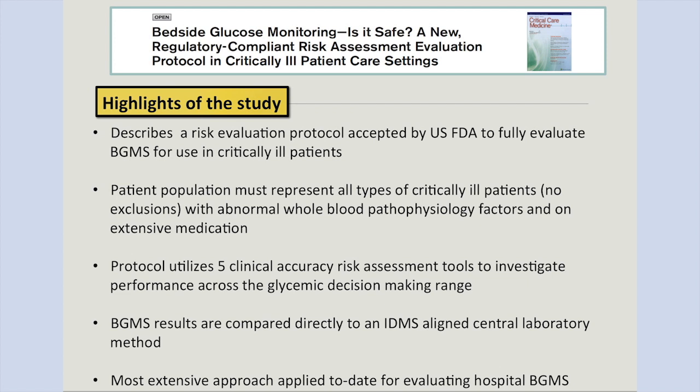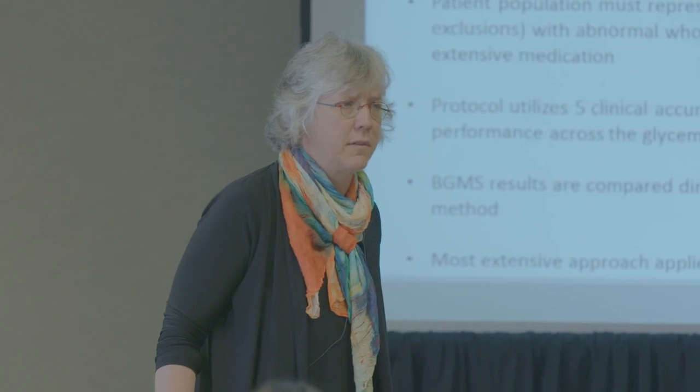And that really is assessing the clinical or analytical accuracy. But what we had to do is come up with a way to say, what can we use to assess clinical risk? Because honestly, I can talk to my neonatologist in Saskatoon, and I can tell them, oh, did you know that the bias is this, and the imprecision is this, and the total analytical error is this?